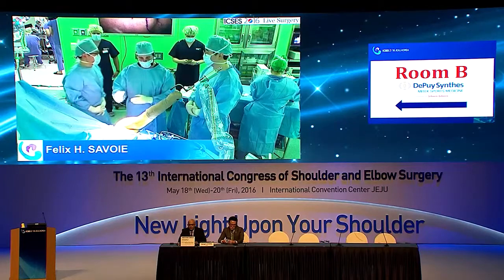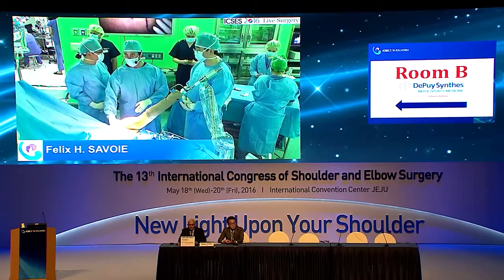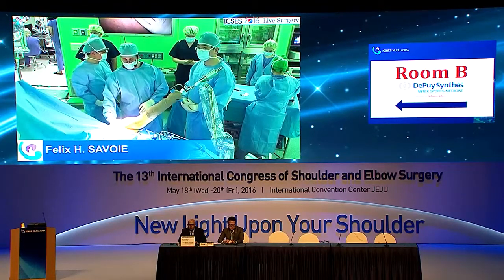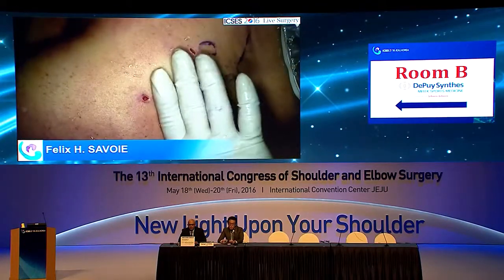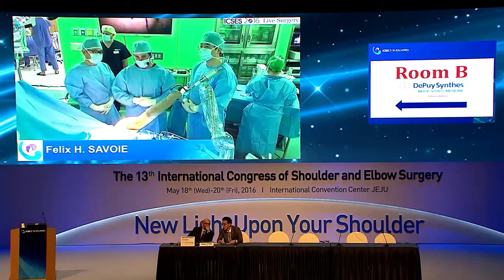So it's always oblique. And in this lady, because I thought it was more of a pulling away, pull medial and posterior, I needed to bring it back this way for my medial row. And then the lateral row, at that point, was outside of the cleavage. I needed to lay that down straight down. So that was a decision we made, when we looked from inside and then outside, from the back and from the side, that's the way that one needed to go.